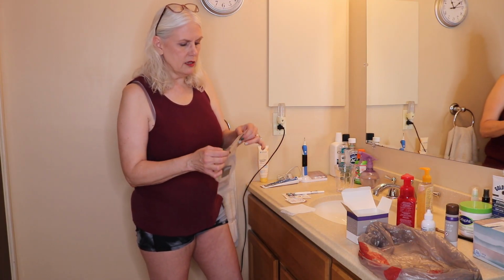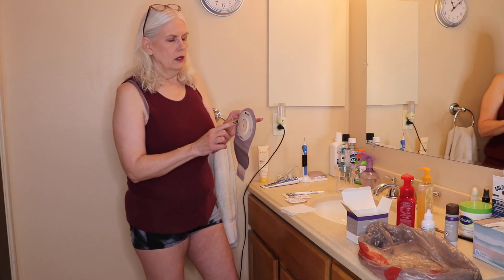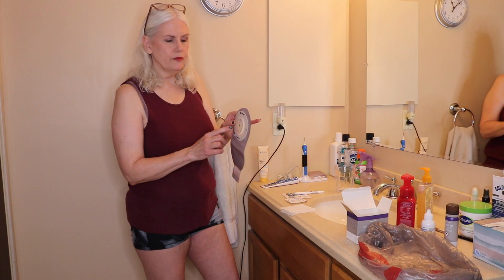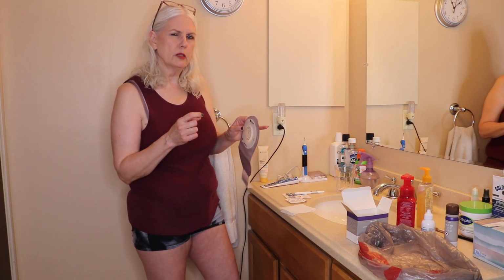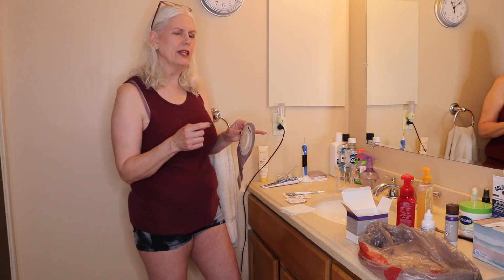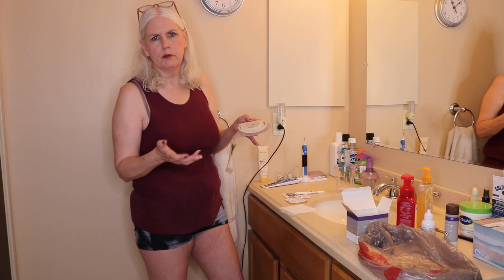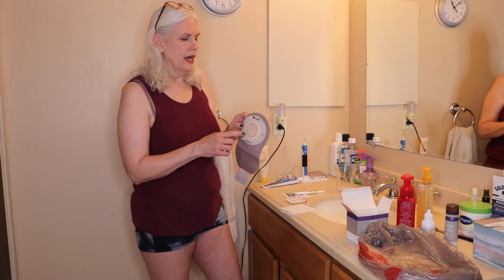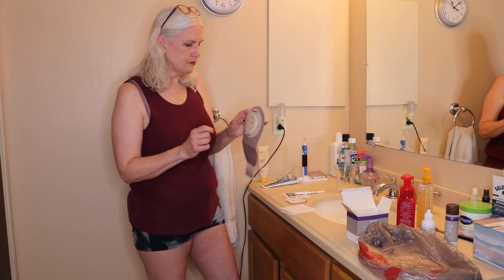And this Esteem Body bag also has a convex flange on there. So that's kind of nice too. Sometimes my stoma retracts just a little bit. Sometimes it's out just enough. It used to be out a little further. It's gone back a tad and it's stayed where it's at now. It's been this way for a long time, but I like also having the convex area.